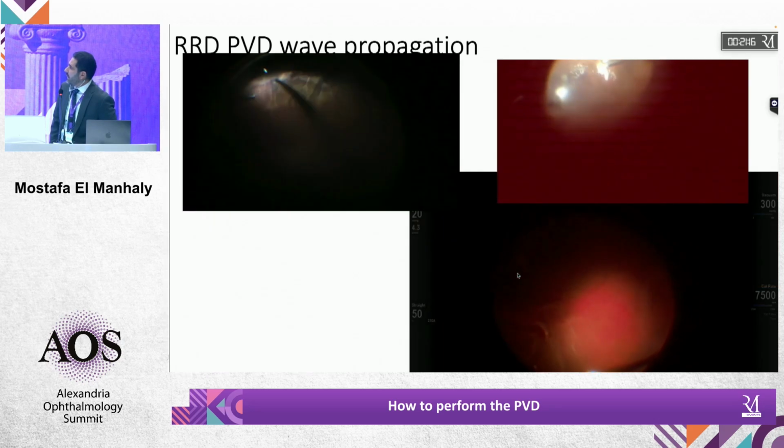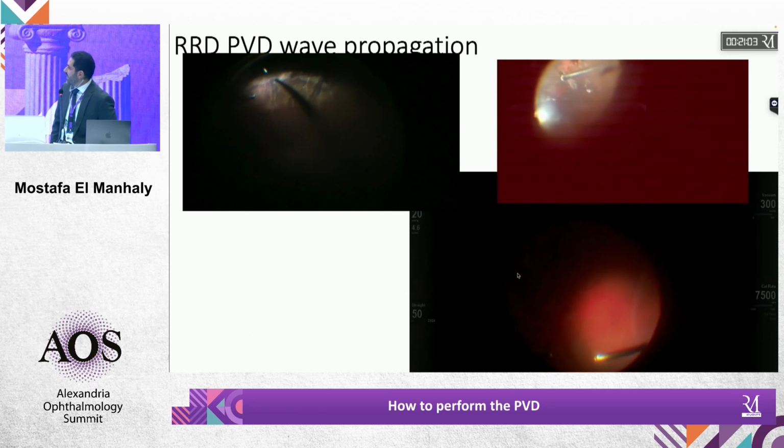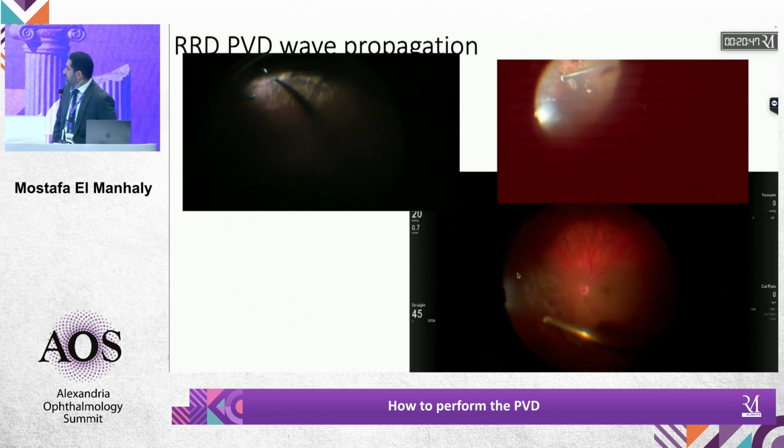Okay, Dr. Moghazi, if we have this scenario and we try to do a complete shaving, or an ora serrata shaving over the flap tear, how will you do it? Because it's very adherent at this area. Is it important to remove it first? And how will you remove it if it is important? No, usually with a break like this, I de-roof it. I always de-roof it. So I remove just the attached flap of the retina, all together with the traction. So it would make it easier.